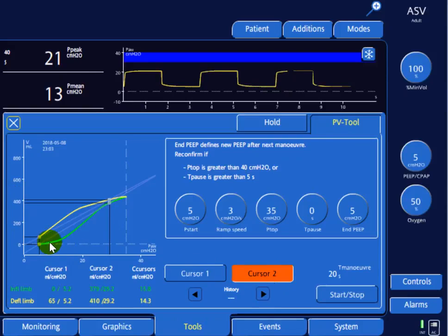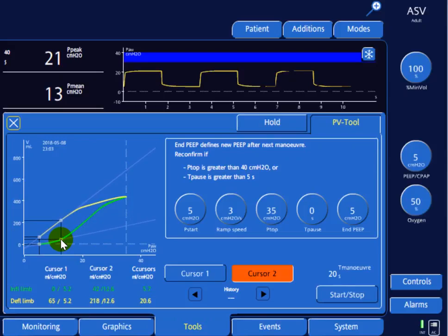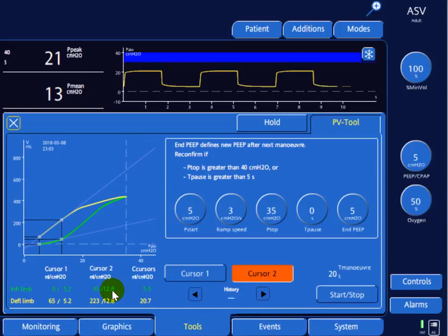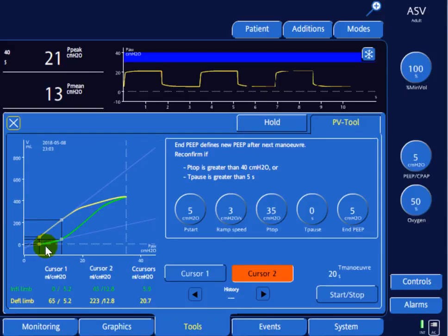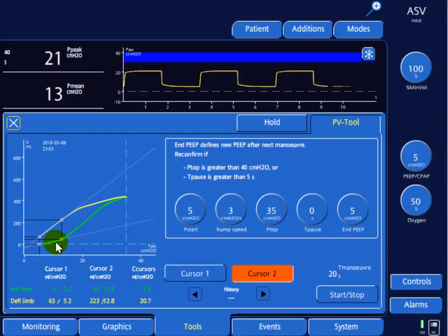We move the second cursor to the area where the slope of the curve appears to change. At this point the second cursor reads a tidal volume of 45 ml at a pressure of 12.8 cmH2O. Comparing the two cursors: the change in volume is 45 minus 0, divided by the change in pressure of approximately 13 minus 5. This defines the compliance for this first segment, which calculates to about 6 — a very low compliance.